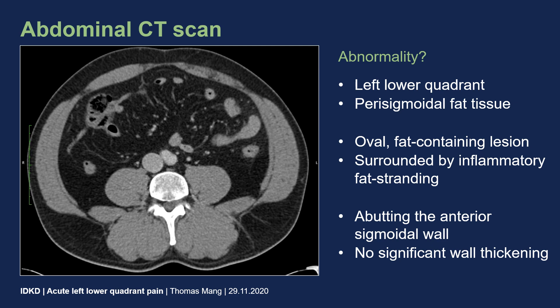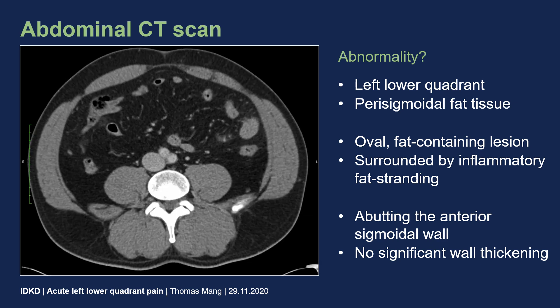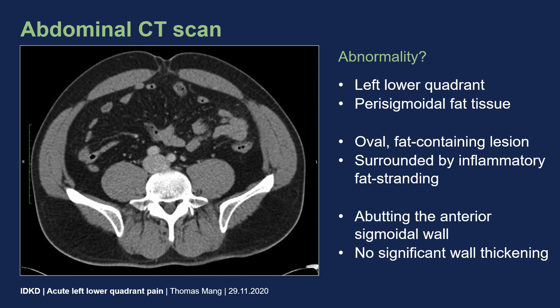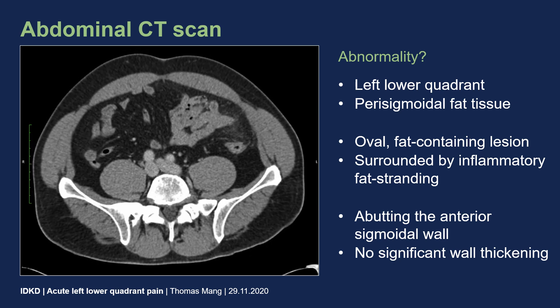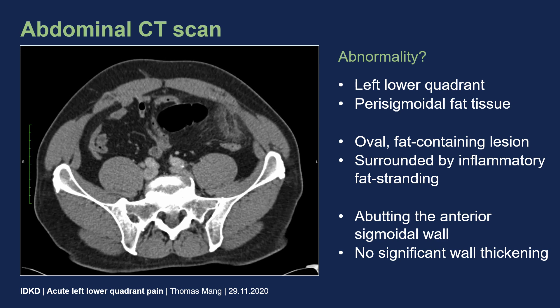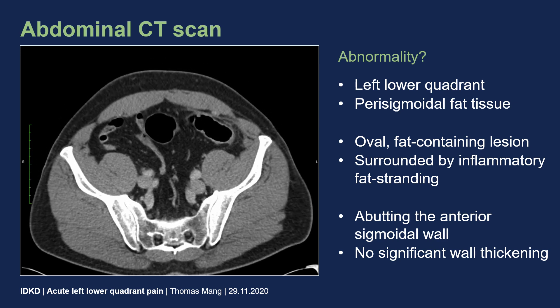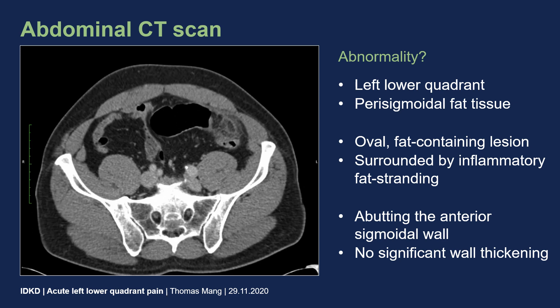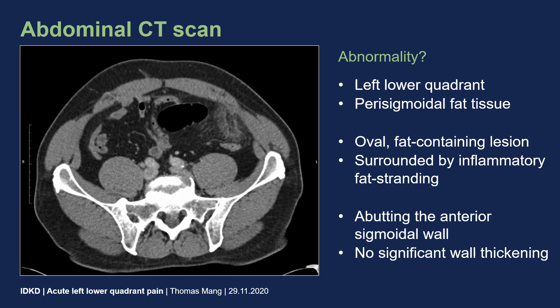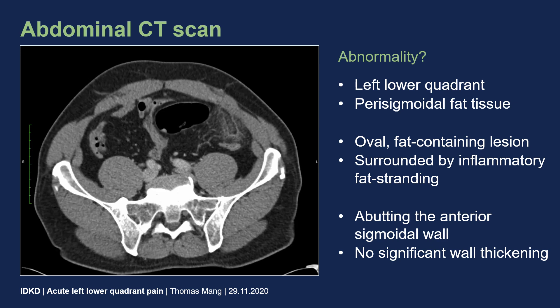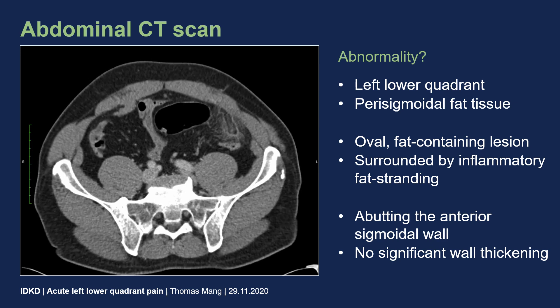Here are the CT images of the patient. The first step is to search for any abnormality within this dataset. I'm scrolling now towards the pelvic region, and there is an abnormality located within the left lower quadrant. It's located in front of the sigmoid colon in the perisigmoidal fat tissue. It has an oval shape, contains fat tissue, and is surrounded by fat stranding.